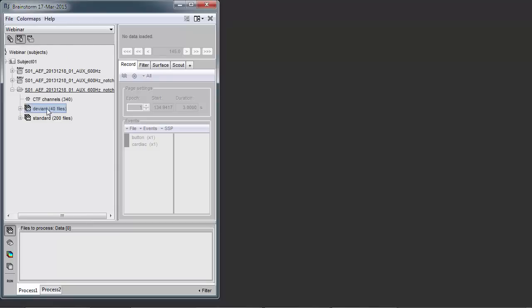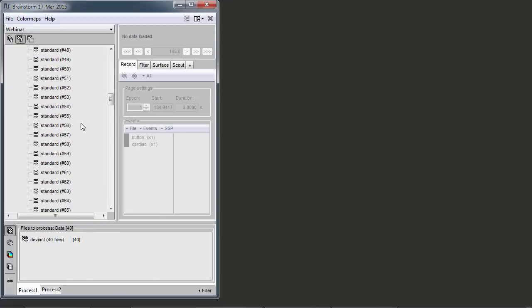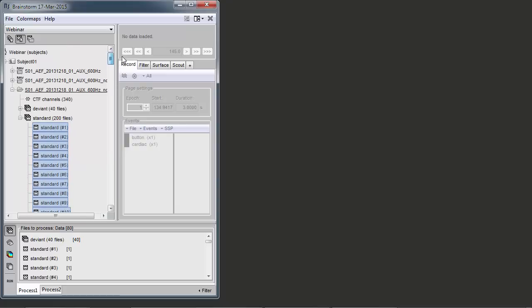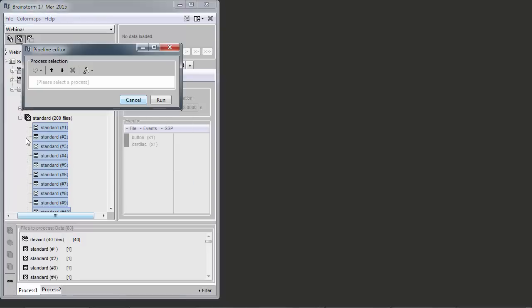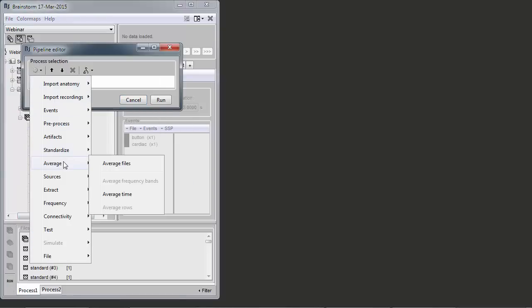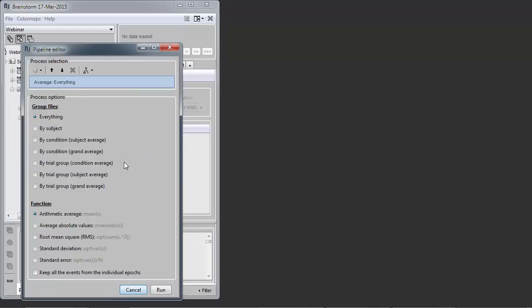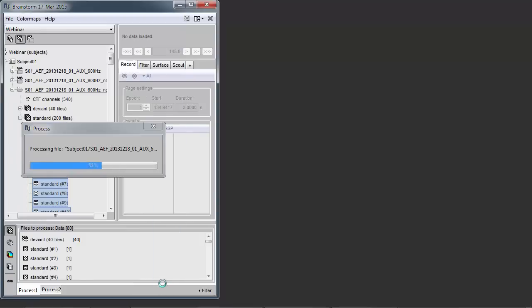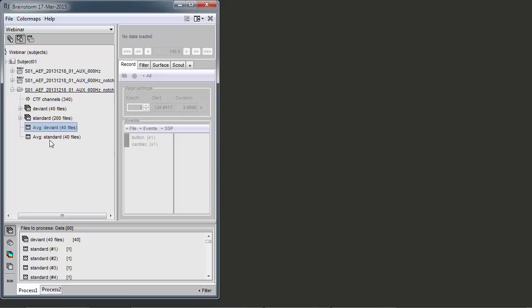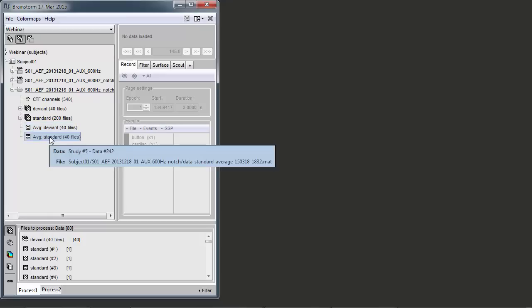There's not much we can do with just one trial, so we're going to average multiple trials from the same category together. I select 40 responses to deviant tones and 40 responses to standard tones so we have the same number of events — all well documented in the process tab. I select from the library the average function and average files by condition. It generates two new files signaled as average.